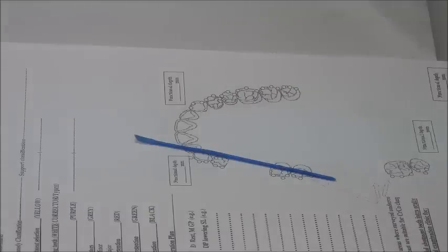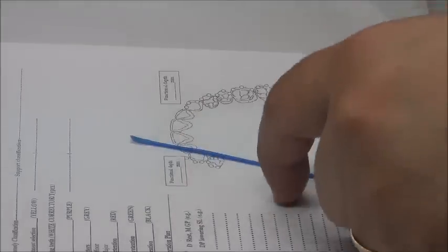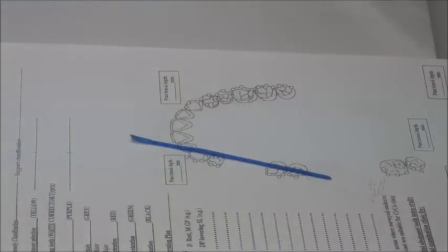And I need cross-arch stabilization. I need two clasps here. I need that support to go to the other side as well. I need some reciprocation from the other side of the stabilization. So I do extend to the other side. Okay?